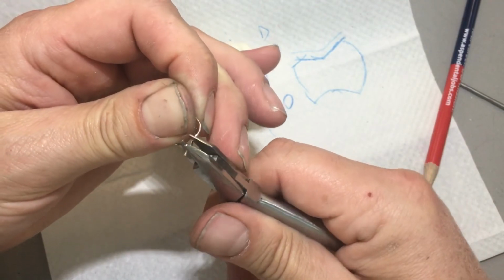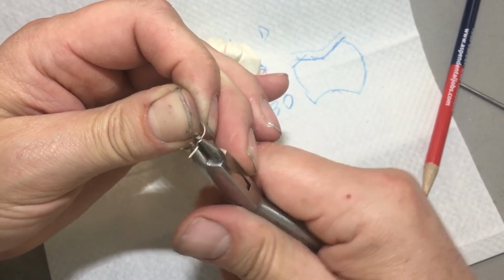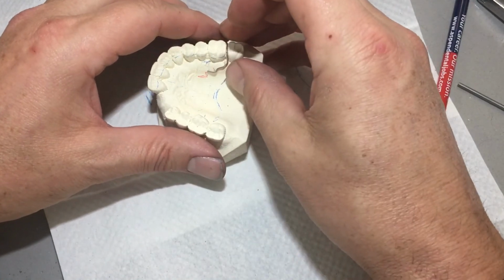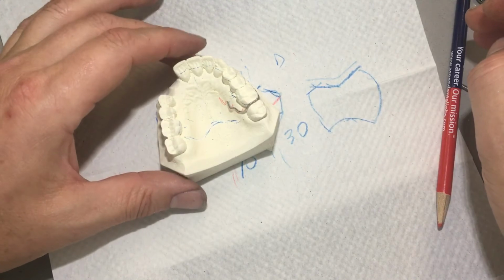Now, if this needed to go for a try-in for aesthetic reasons, you could do an acrylic base plate and set up 2 teeth and send it for try-in. But this is a transitional, immediate, so to speak. And there we have it. This one is finished.